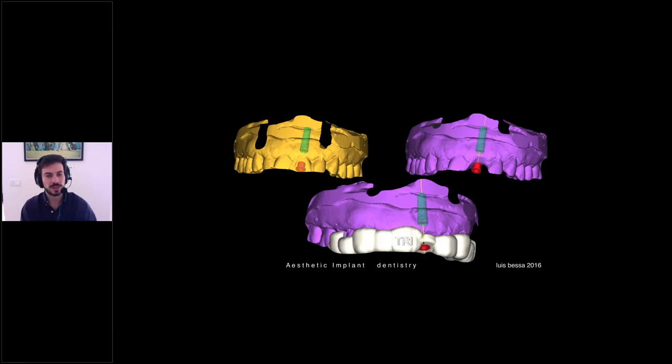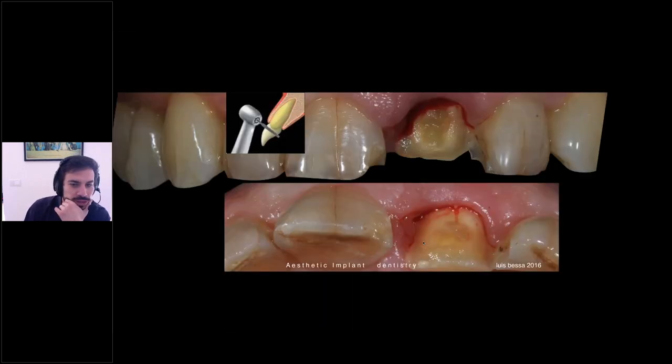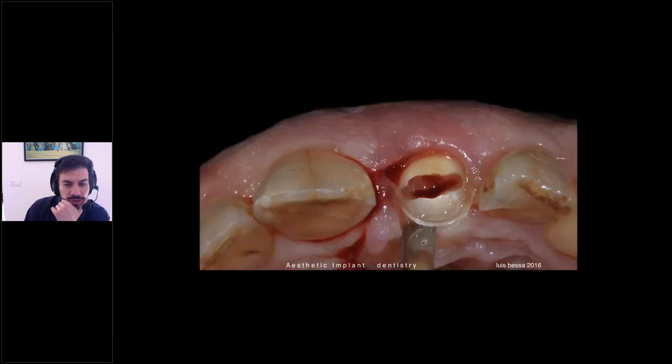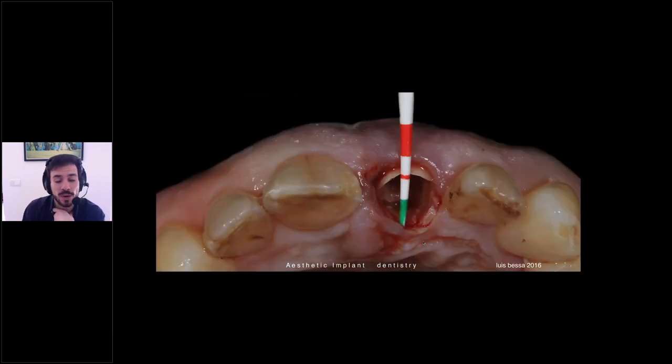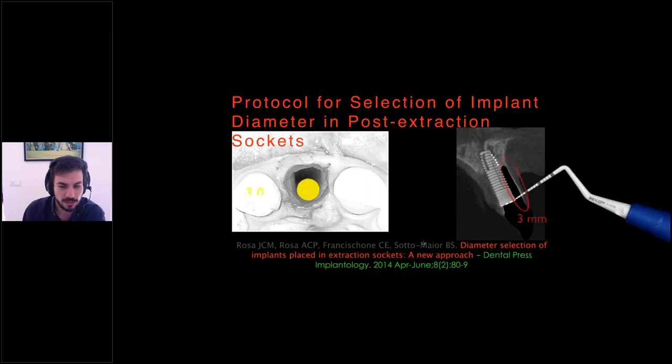We plan all the surgery. We superimpose a CBCT and the STL model. We plan to put an implant of 4.1 by 13 millimeters. Therefore, we have made the coronectomy, the preparation of the crown, the root, the extraction of the palatal part of the root, maintaining the buccal one to maintain our bundle bone and our periodontal ligament, which is giving a blood supply to the buccal bone. Then we select our implant according to this article that I showed before.